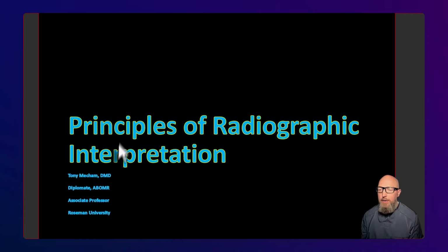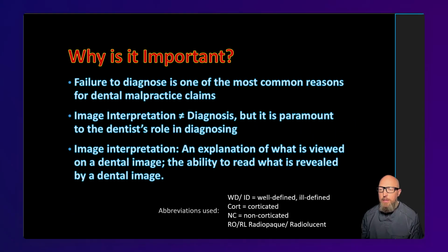And why does this matter? Well, for two reasons, and to quote Mahatma Gandhi, a correct diagnosis is 3/4 of the remedy. If something's missed or misdiagnosed on a radiograph, treatment is either going to be delayed, incorrect, or in some cases unnecessary completely. So misdiagnosis is also one of the most common reasons for dental malpractice claims.